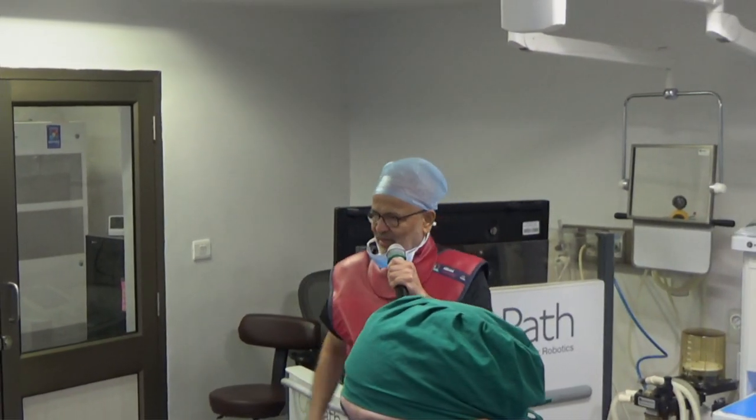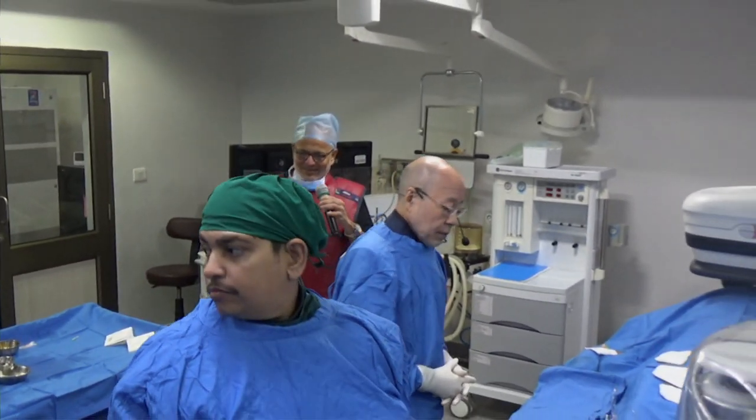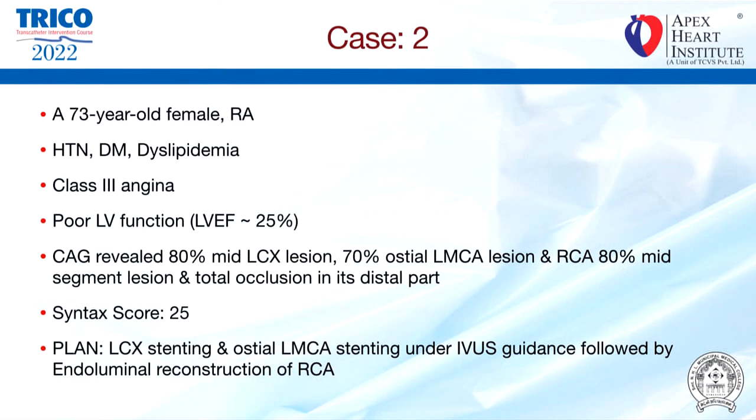Just great to hear. Yes, Samir, how was the vasoband? We're all very keen to know if that worked. So yesterday's vasoband case, I just went this morning to do an ultrasound on the lady, and the artery is widely patent. You'd be surprised, it was a 1.5 millimeter vessel that we had put a 6-French sheath in. With the vasoband, it was widely patent. I have the ultrasound on my phone that I recorded, and the reverse Barbeau test came out perfect. That's a randomized trial because her right side was occluded, and now the left side is patent. I think you proved it.